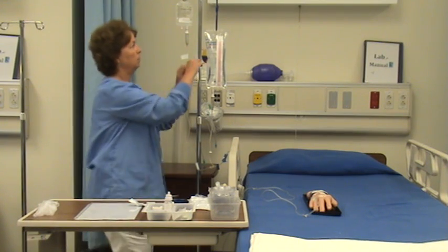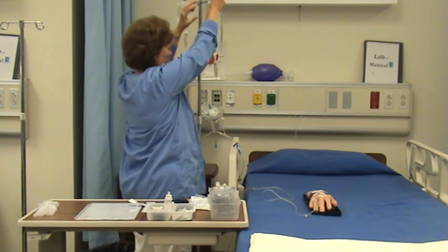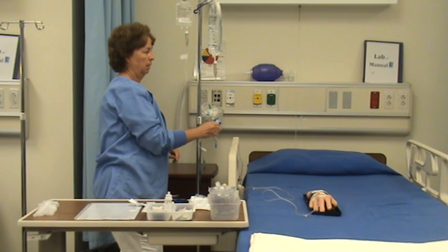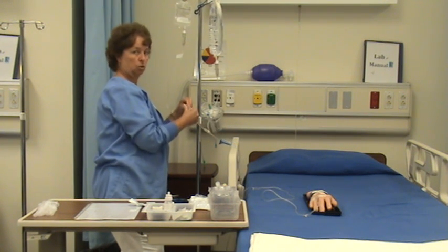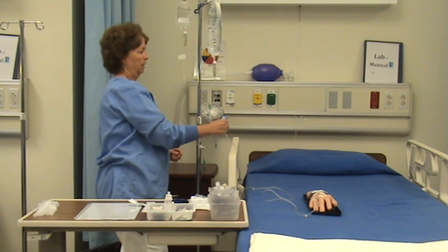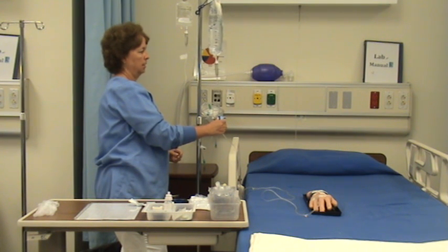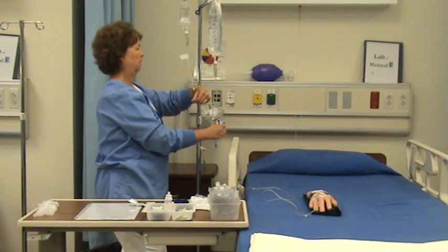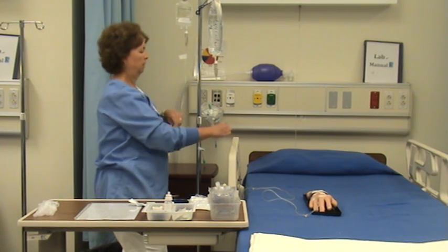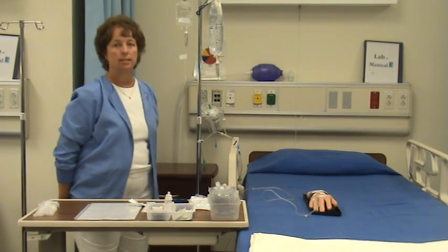What you're going to have to do is raise your primary IV bag and then reset your drops per minute after you close your clamp, close your secondary clamp, and reset your drops per minute at the initial 16 drops per minute. Okay, and that's administering an IV piggyback through an existing IV line.